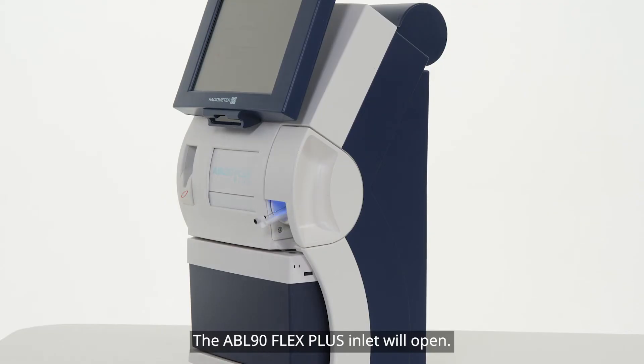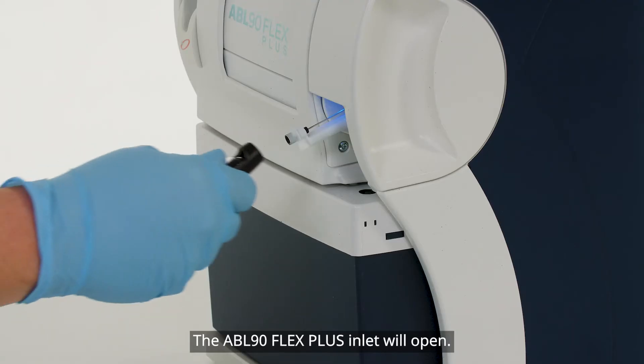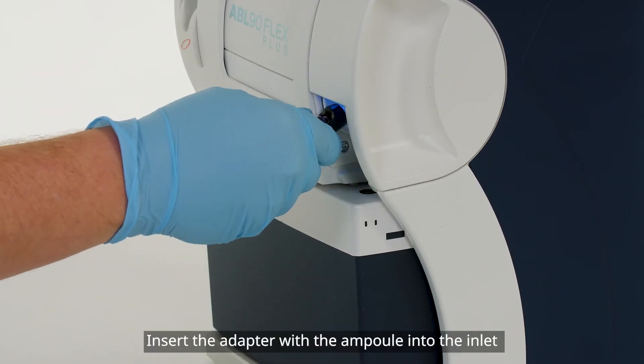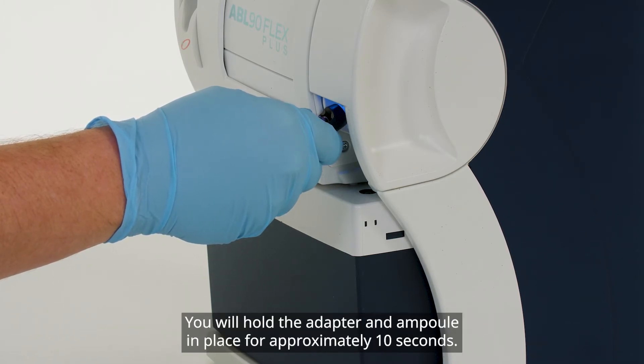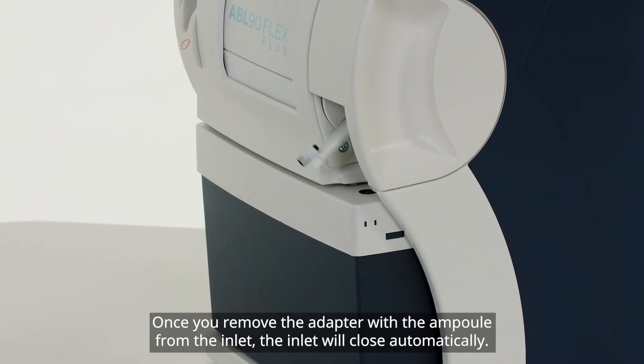The ABL90 Flex Plus inlet will open. Insert the adapter with the ampoule into the inlet and hold until the ABL90 Flex Plus beeps. You will hold the adapter and ampoule in place for approximately 10 seconds. Once you remove the adapter with the ampoule from the inlet, the inlet will close automatically.